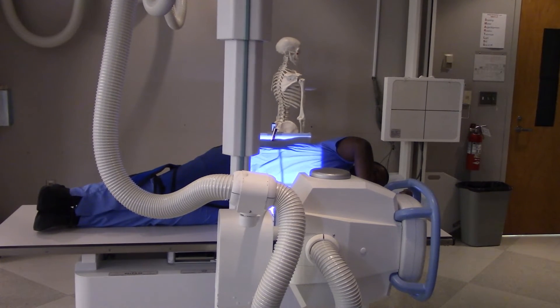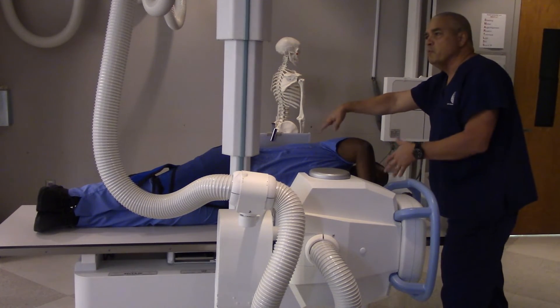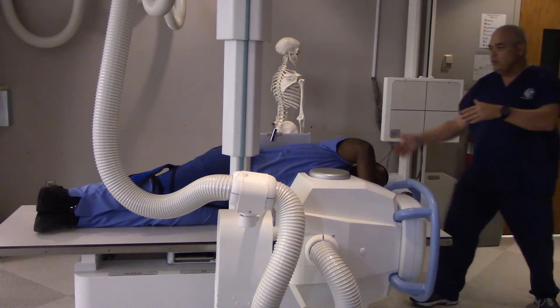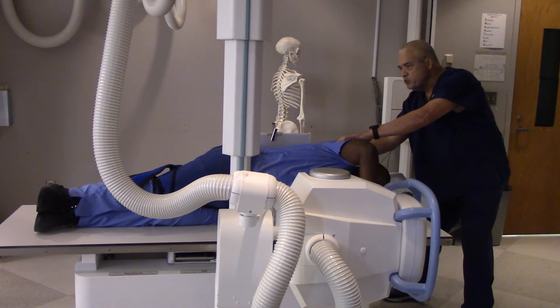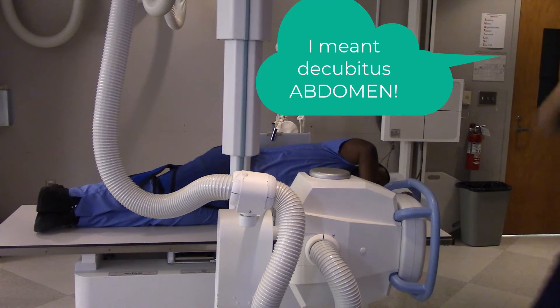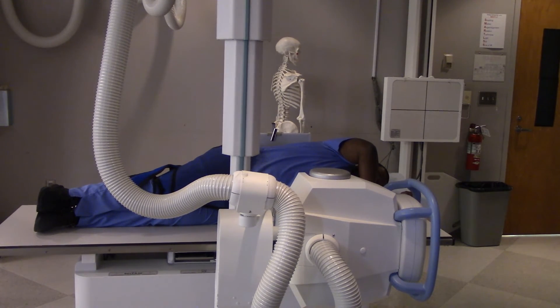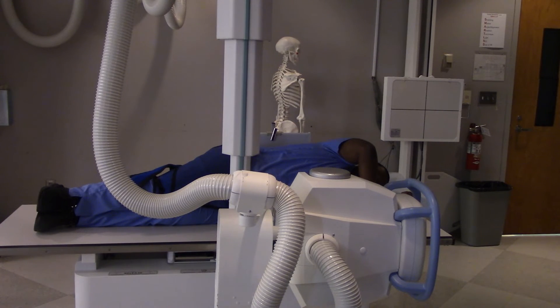I've got the man laid out pretty comfortably. Are his arms up out of the way? Absolutely. Remember, this isn't a chest x-ray — I don't have to worry so much about his arms being in the way as I did with the decubitus chest. He is relatively straight; I can look at his shoulders and see they're lined up one on top of the other. If he's leaned back or rolled forward, I'd say, 'Sir, could you roll forward just a little bit? Hold that position. Hold still.' Should I do this on inspiration or expiration? Expiration — that takes some of the compression off the abdominal tissue. So sir, if you wouldn't mind, take in a big deep breath for me. Blow it all the way out. Hold it out and hold still. Beep. Outstanding, you can relax and breathe normally.